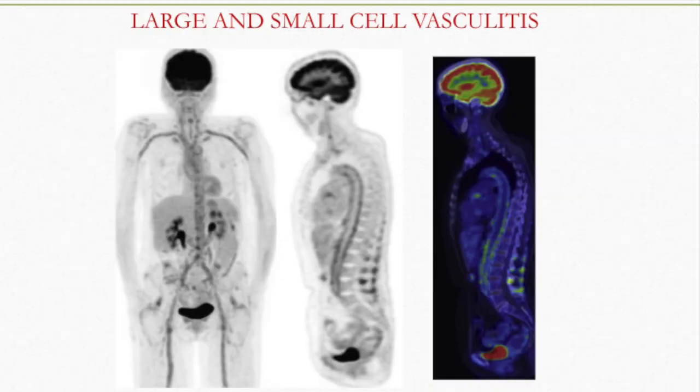As I have already shown large vasculitis, medium as well as small vessel vasculitis is also an important indication for evaluation by PET-CT. You can see diffuse uptake in the iliac vessels, the proximal arteries of both thighs, and the proximal aspects of the subclavian vessels.